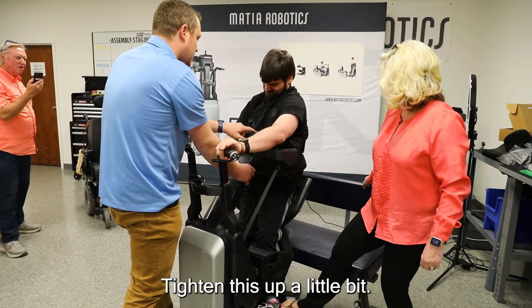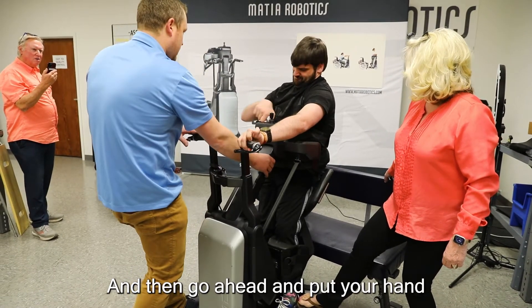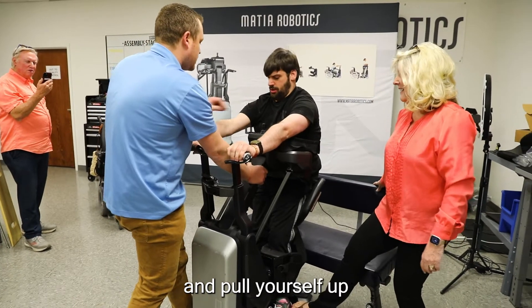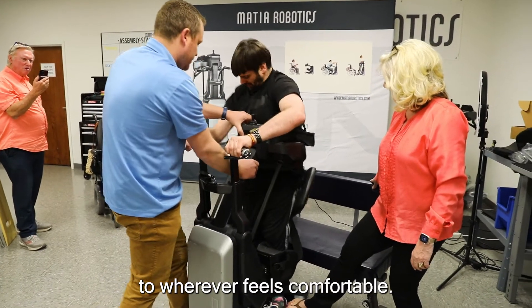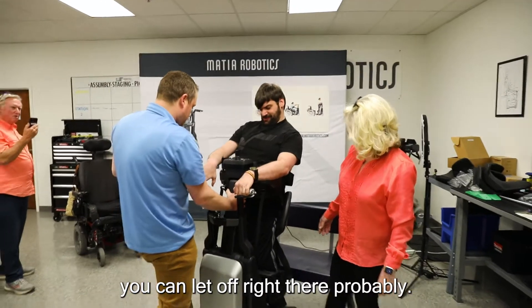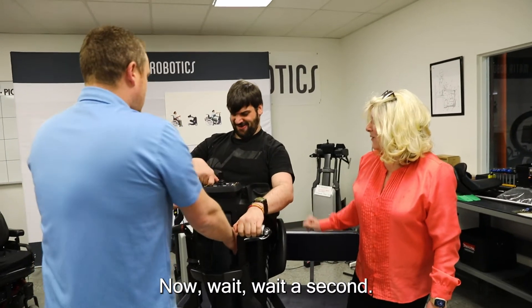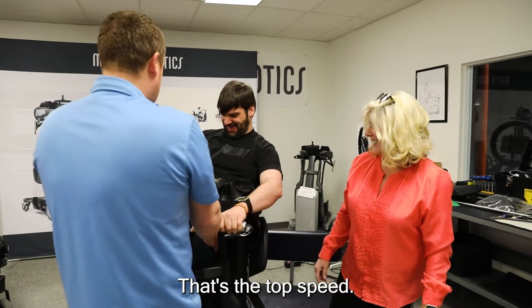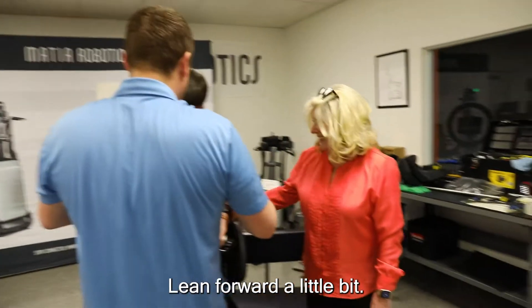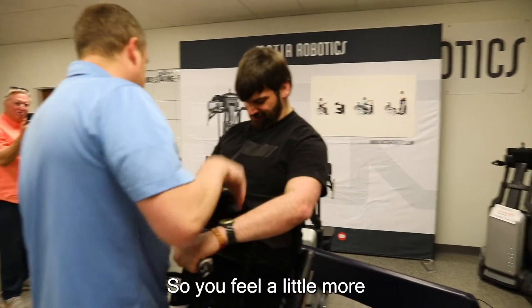Don't drive it quite yet — tighten this up a little bit. Then go ahead and put your hand right here, you're gonna squeeze just this side and pull yourself up to wherever feels comfortable. You don't have to go all the way up, just whatever feels comfortable. You can let off right there — probably so we don't hyperextend your knees. I'm going to start you out at the top speed I would start people at — slow.